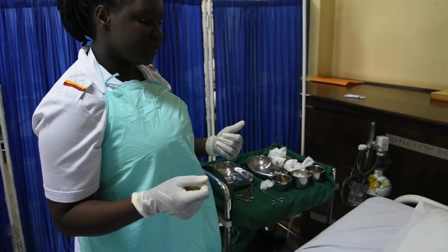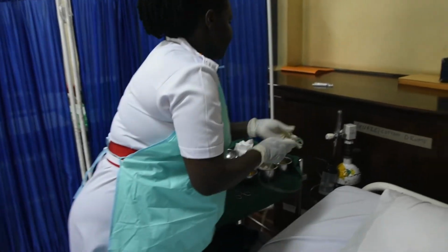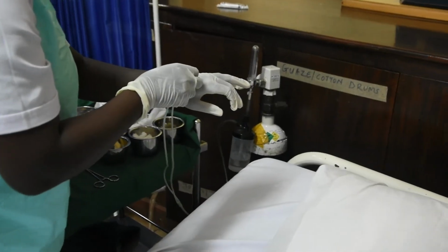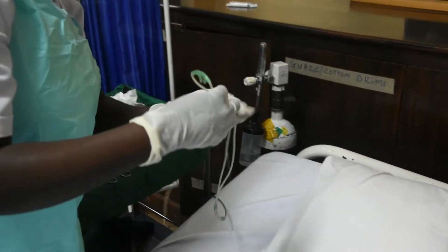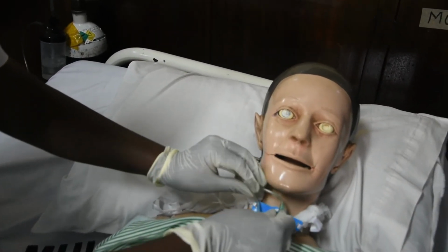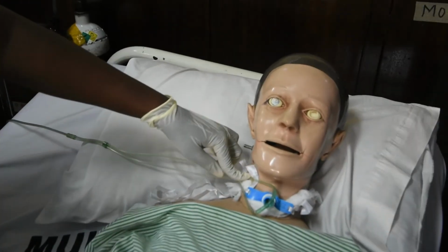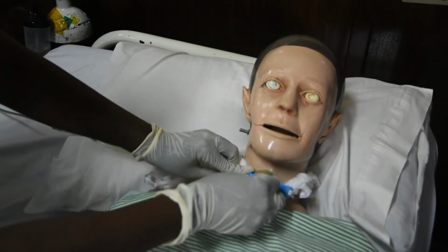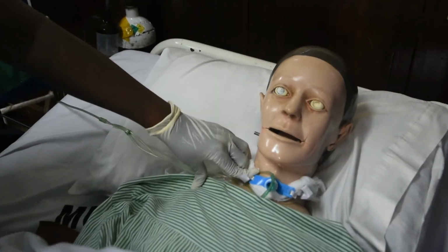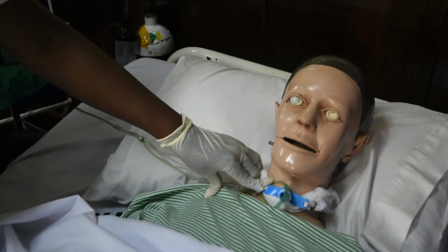But in case our patient was on oxygen, then we have to connect nasal prongs onto the patient. Okay, oxygen is working. Then we have to connect our nasal prongs onto the patient like this. Assistant, you help me with strapping, then we secure the oxygen tubings. Thank you, Mr. Mulago, for being cooperative. Hope you're now comfortable. We can now clear away and thank our patient.